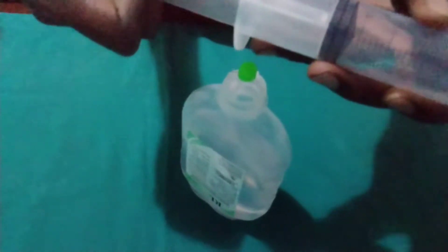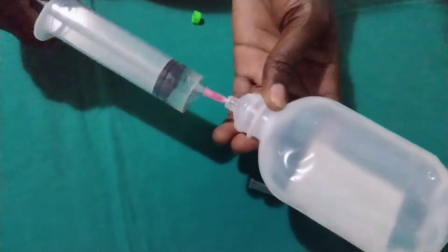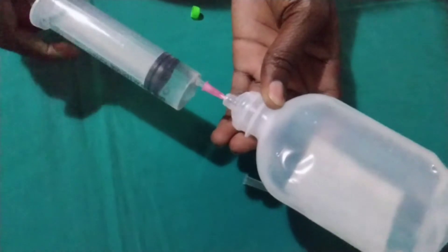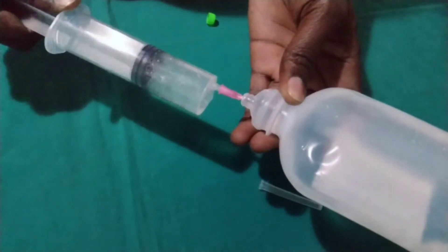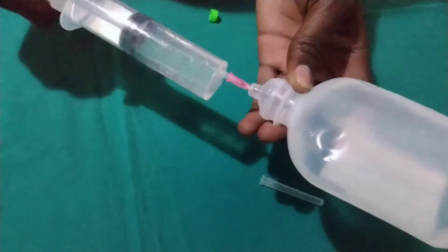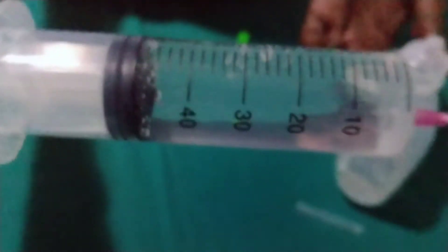You can see this one has its needle, so we are going to use this very needle. And you see, we have aspirated 50 mils as you can see. So we are going to dispel that one away.